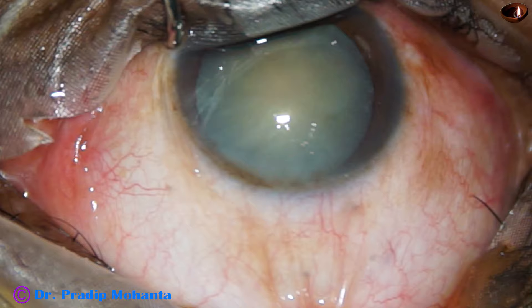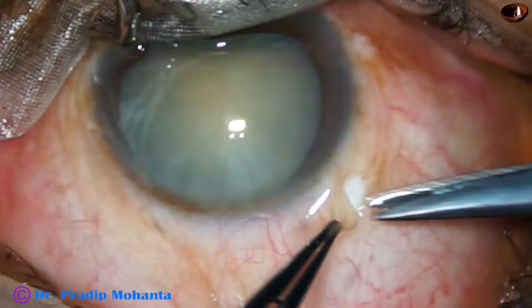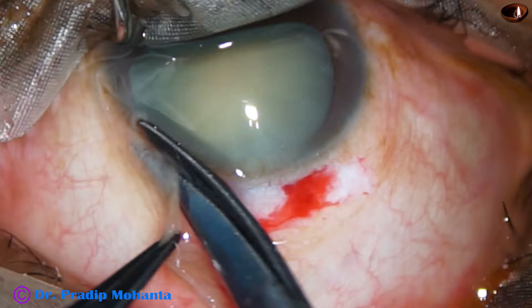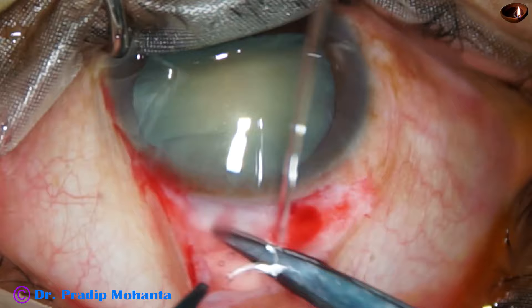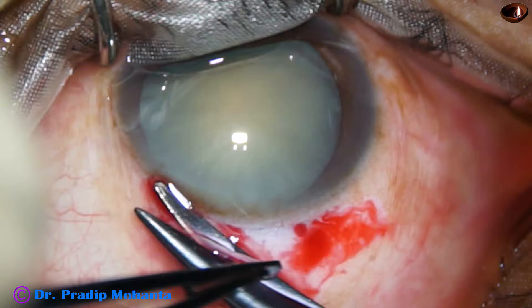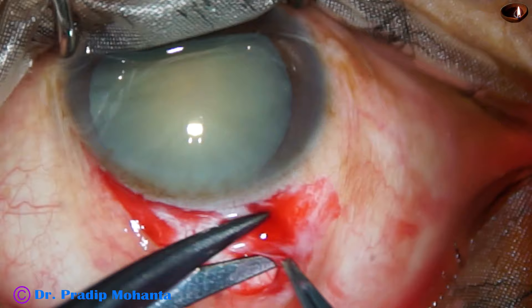We go to a little higher magnification. Our conjunctival peritomy is being done for about two and a half clock hours, from 11 o'clock to 1:30 o'clock. You can see this is a mature white cataract. The patient cannot afford phacoemulsification, and this is a good option for those who cannot. If we do this surgery with a lot of care, the results are very good. Induced astigmatism is within one diopter, and if we place the incision on the steep axis, it can actually correct the existing astigmatism.